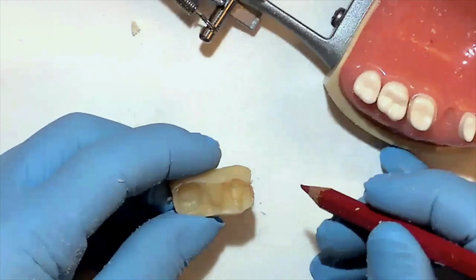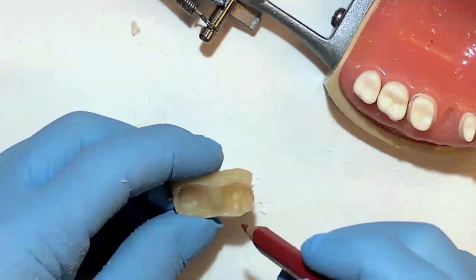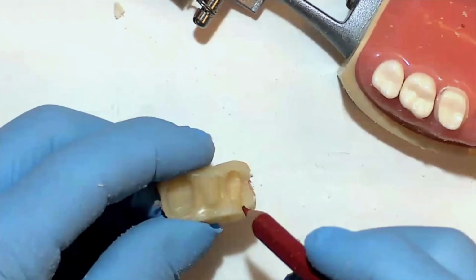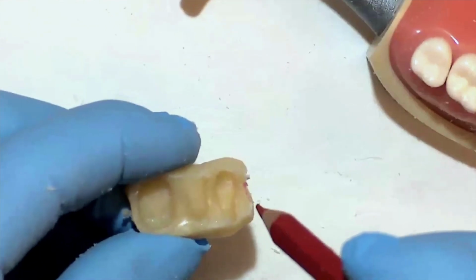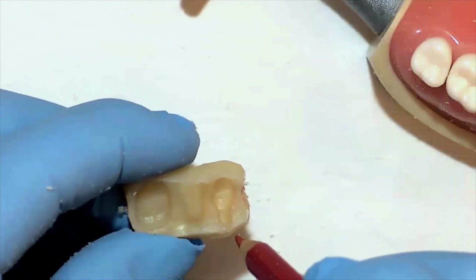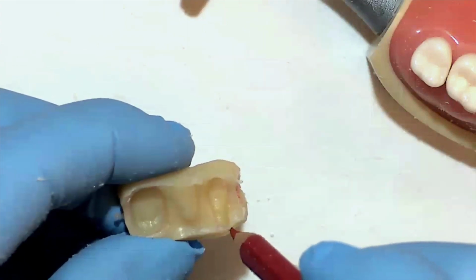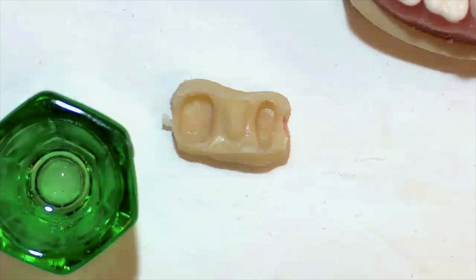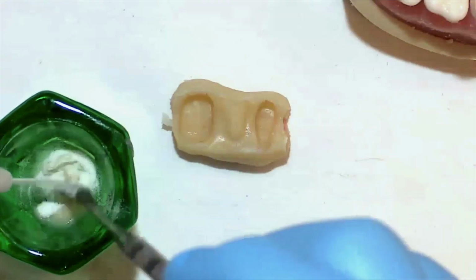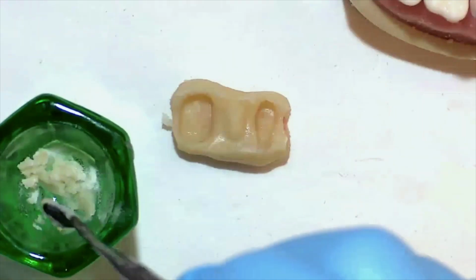Now I want to point out something on the intaglio surface of the premolar. We have a bit of a pull that occurred because the acrylic did not adapt to this surface right here. You can see this. So an easy way to fix this is to just reline that one area, which we're going to do with some acrylic. Mix up a little bit of acrylic. A little bit too dry there. We need a little more liquid.